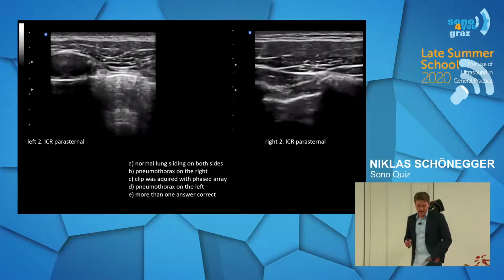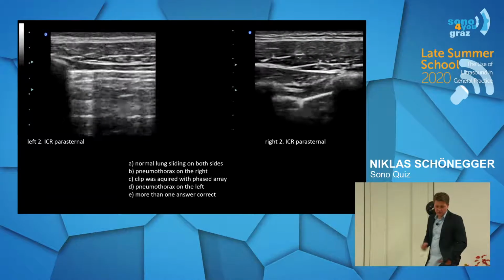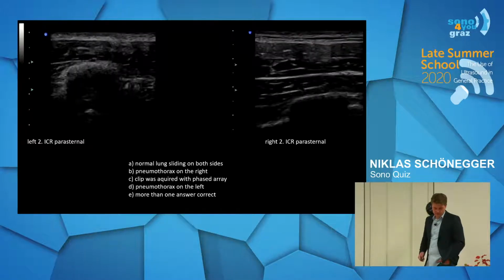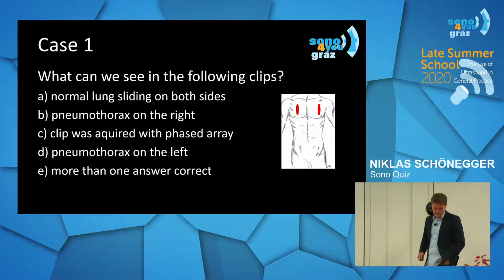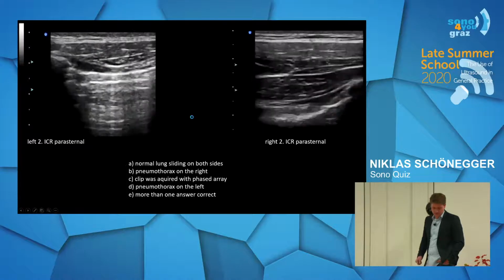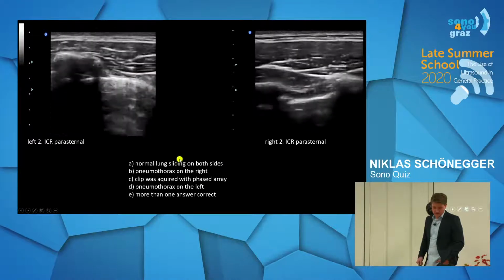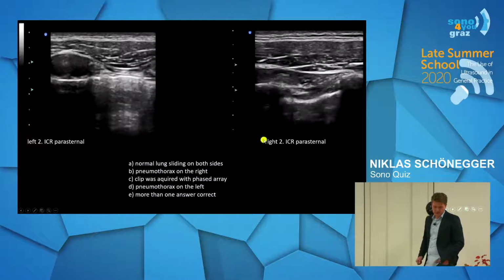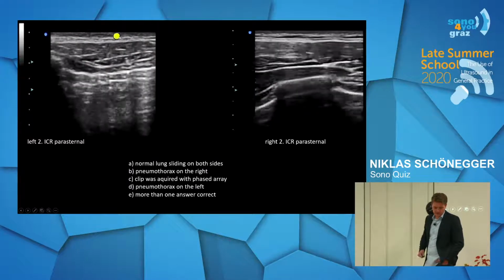Okay. Do you think there is pneumothorax? Do you think there was pneumothorax on the right clip? Was this clip acquired with phased array?